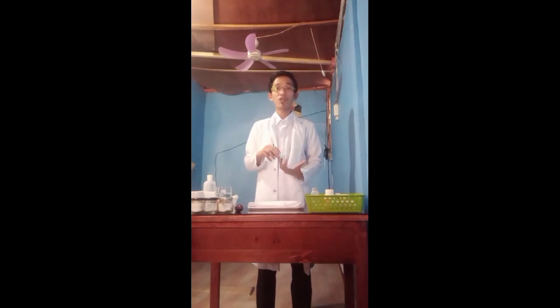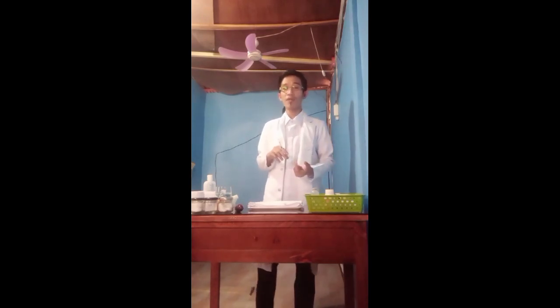Then recheck the volume of medication. The reason for this is to allow fluid to settle at the bottom of the barrel and allow the fluid within the needle to enter the barrel so it's not expelled, and to expel air at the top of the barrel and within the needle. So next, if the medication will be injected into the patient's tissue, change the needle to the appropriate gauge and length. Inserting needles through the rubber stopper dulls the tip of the needle. So I'm already changing it from the gauge 23 that I was using before.